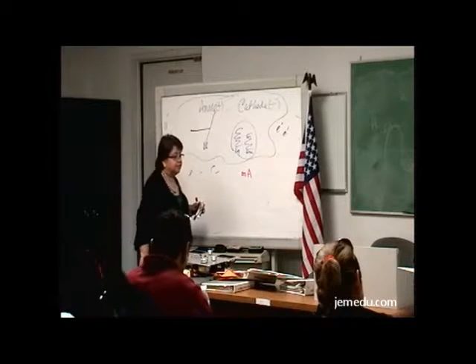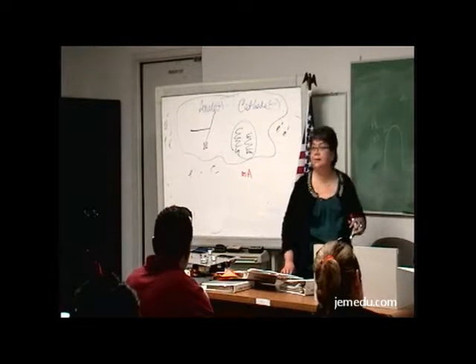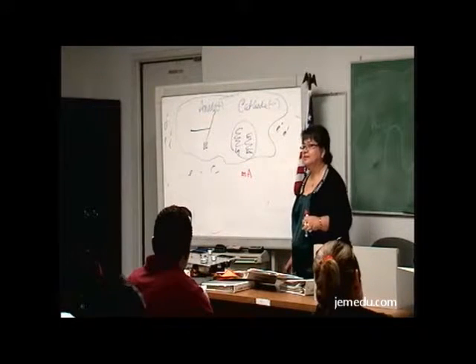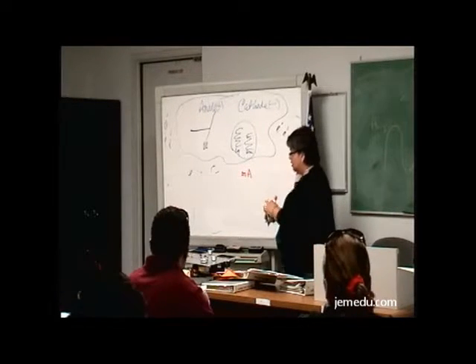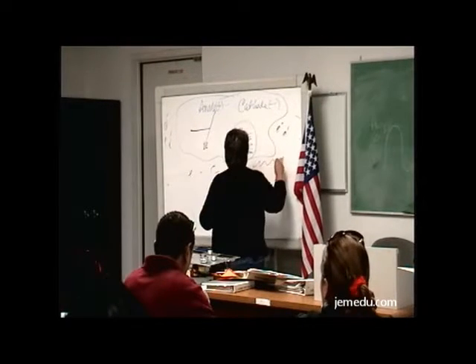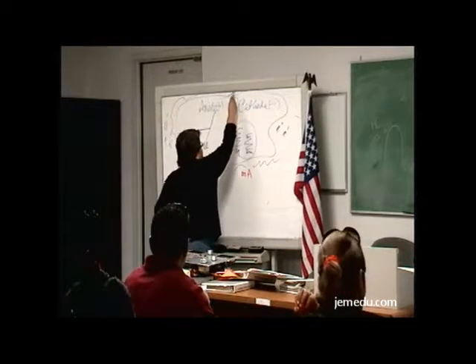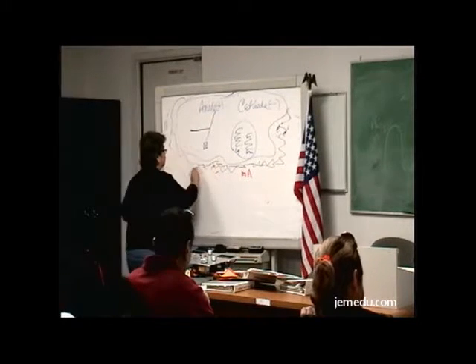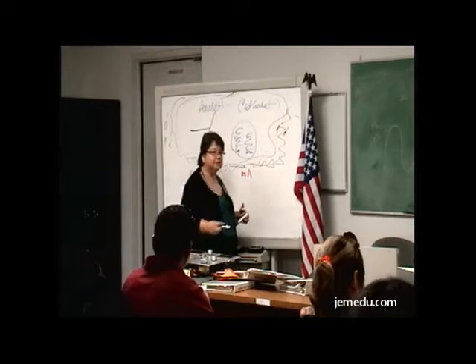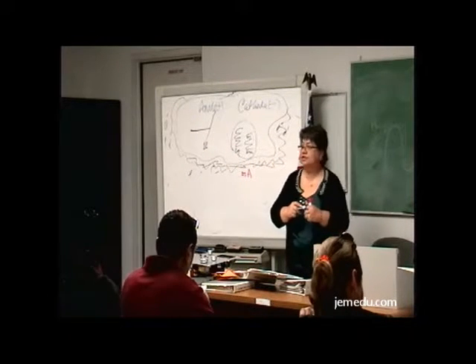All right, now what's around the X-ray glass? What's around the Pyrex glass? Lead? Not quite yet. Oil. We have oil around here. Why do we have oil? Encasing. Do we want it slippery inside or what? To cool, yeah. We use this as a cooling agent.